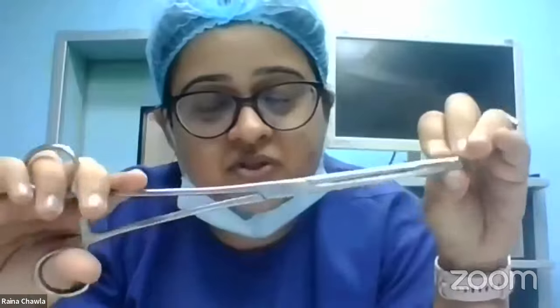So this is a sponge holding forceps or a ring forceps. You can see compared to this, how atraumatic this is. You can see there are just some serrations, but there are no teeth. Okay. So this is traumatic. This is atraumatic. This is preferred when you're doing a suction evacuation for a molar pregnancy, for an incomplete abortion or retained products of conception, where the cervix is very soft. So prefer holding it with a sponge holding forceps.